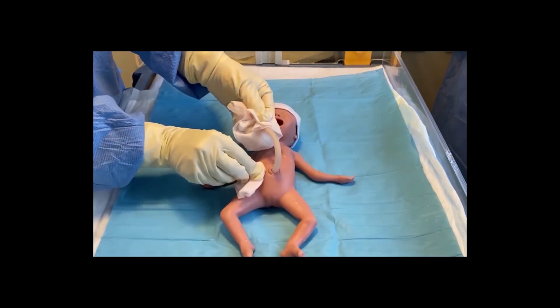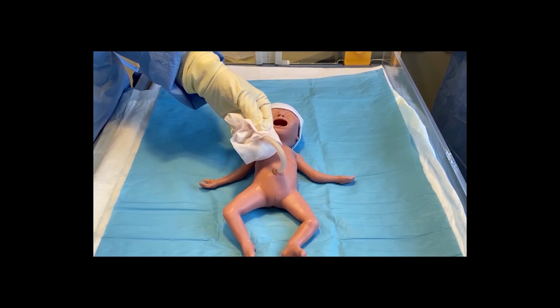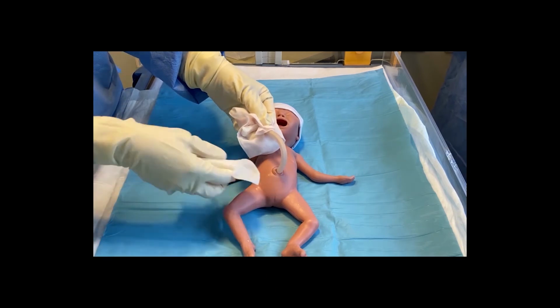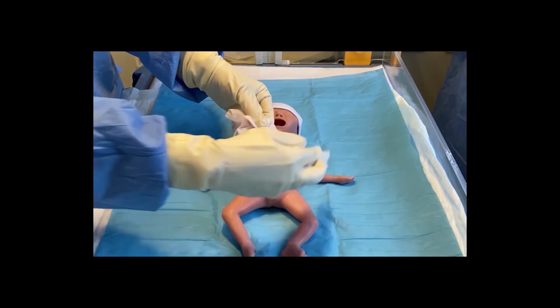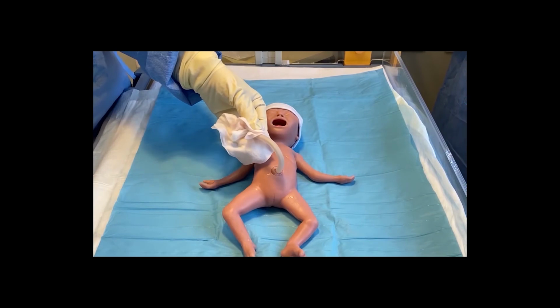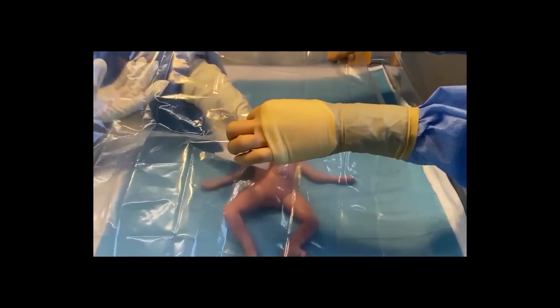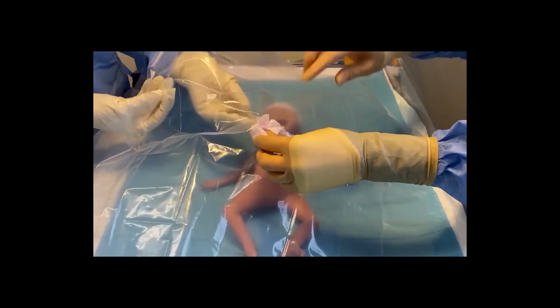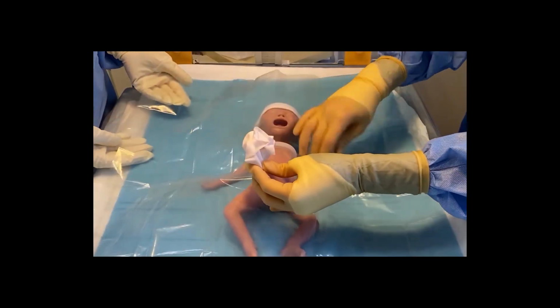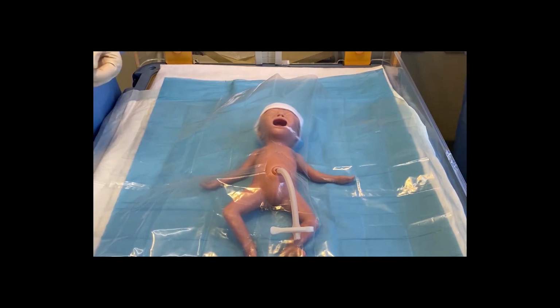skin of the baby. With a preterm baby, remember, you also need to have some water, sterile water soaked on the gauze to clean off that chlorhexidine solution from the skin. Now we can put our sterile drape with a hole cut in it, and your assistant will be able to help you with that. We now have our sterile field, and I can take off my outer layer of gloves.